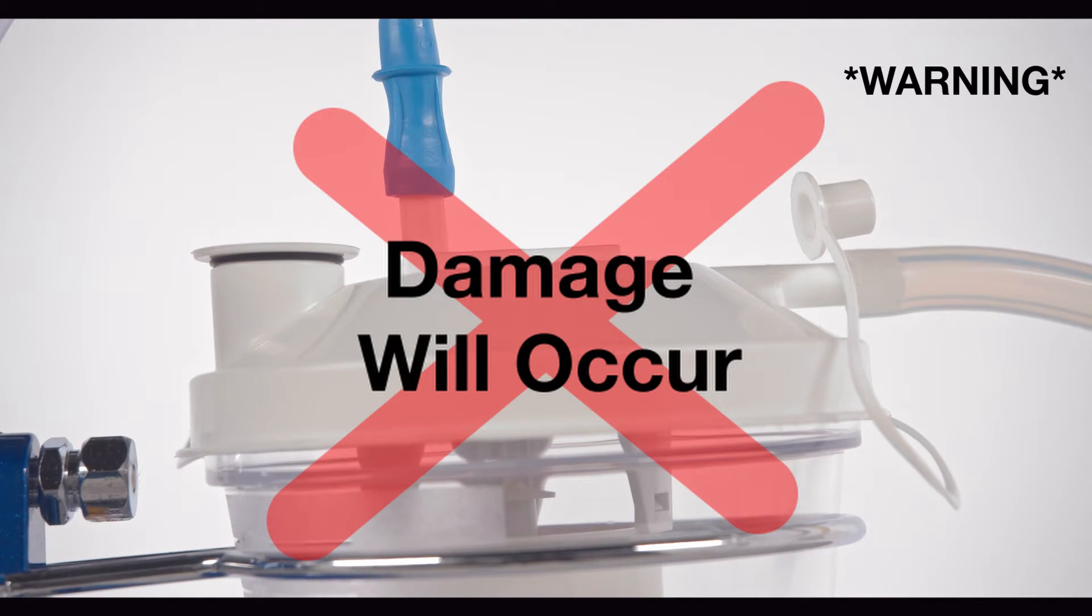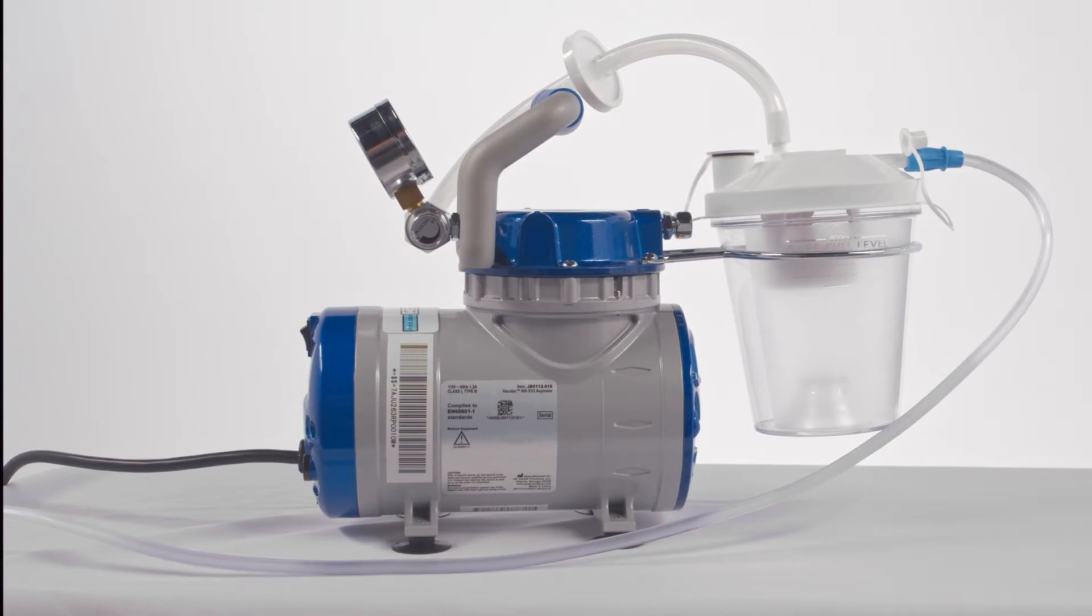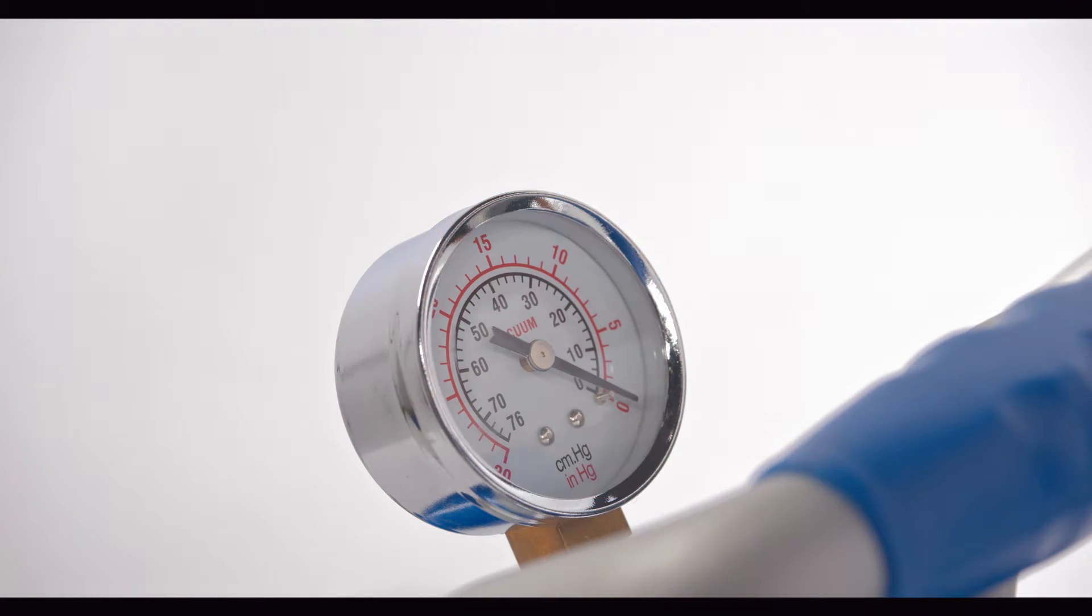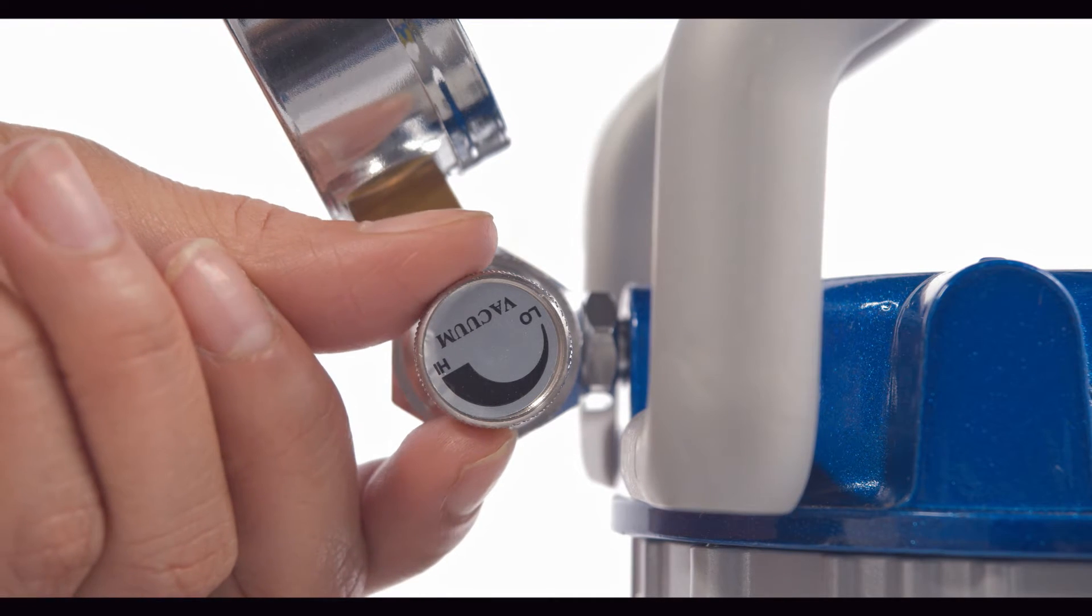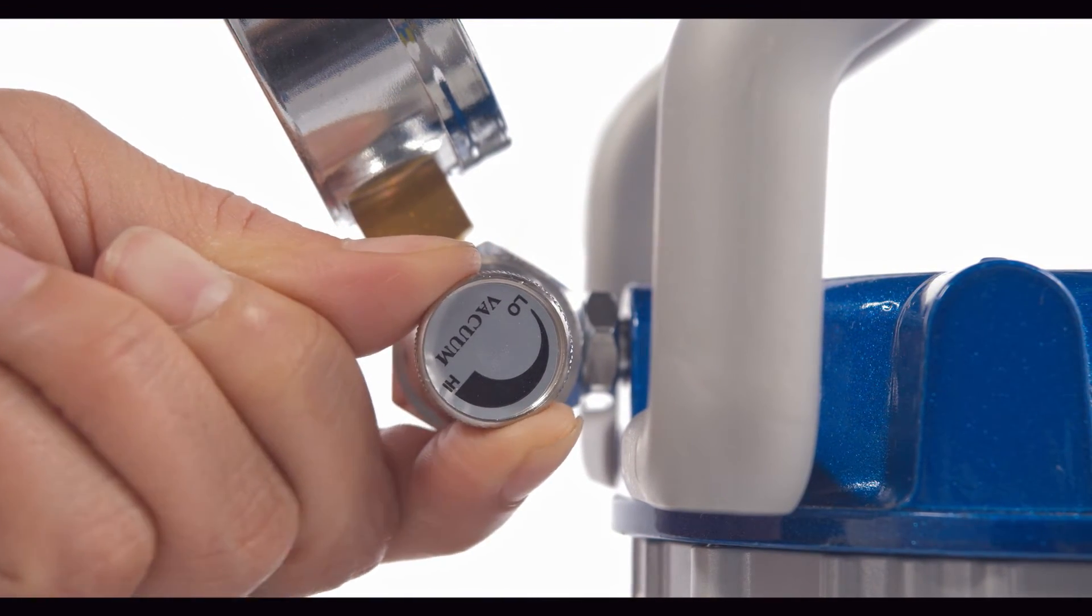After connecting the tubing, your John Bunn aspirator is ready to use. The gauge on the unit will allow you to see the amount of suction pressure. The suction or vacuum adjustment knob can help you properly set the suction pressure based on the recommendations by your healthcare provider.